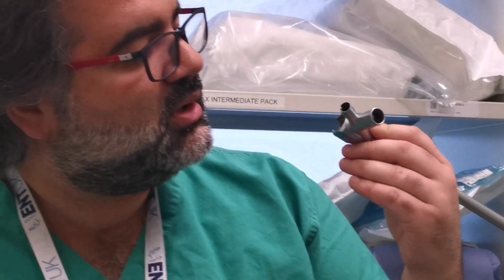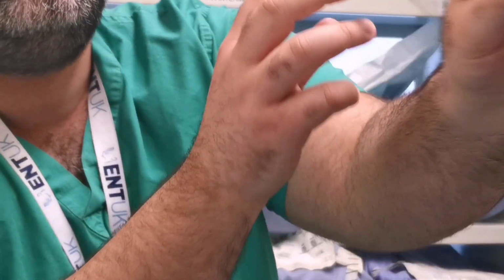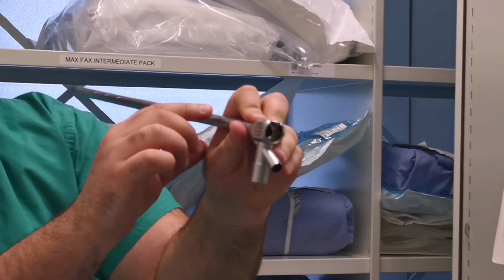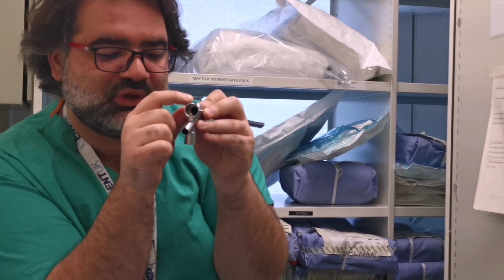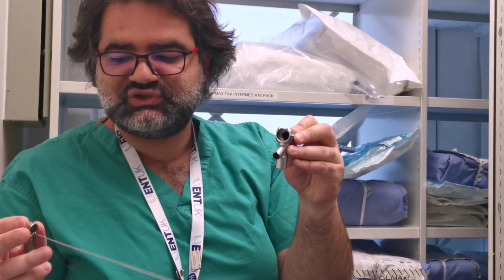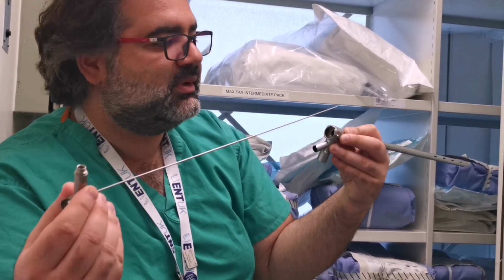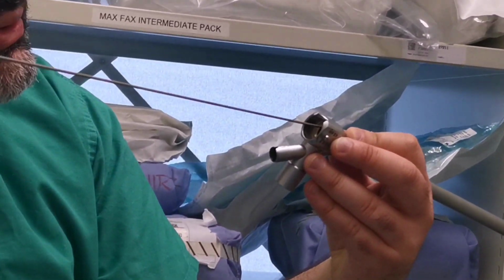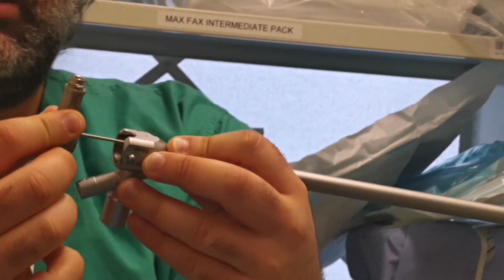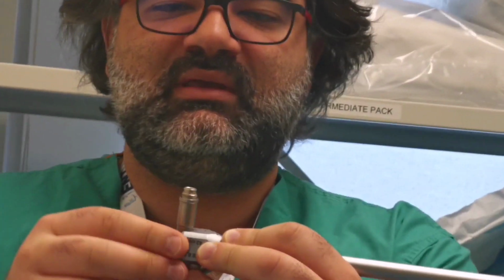First of all, there would be a very small notch there, so everything should be pointing up. Whenever we're assembling the bronchoscope, everything should be pointing up. There's a very small notch. You will find it in all 3 bronchoscopes. The first thing that needs to be fitted would be the light source, and again, always remember everything pointing up. You will have to put your light source in essentially in the groove, okay, so it all slides in nicely and then locks, so everything still pointing upwards.